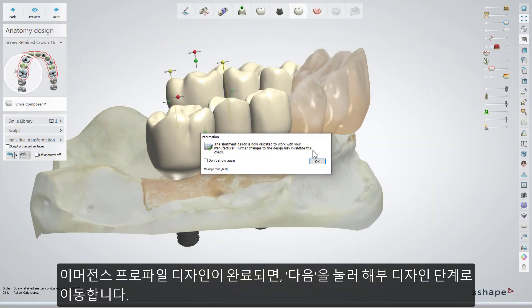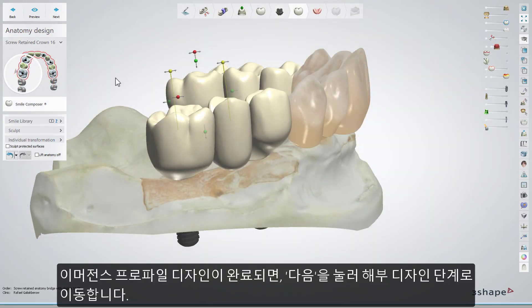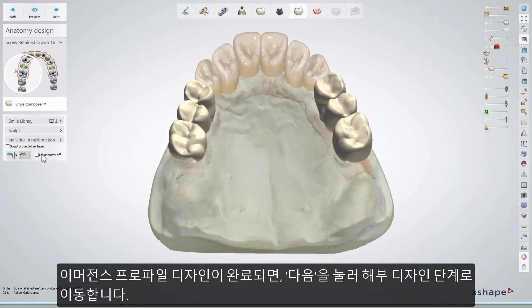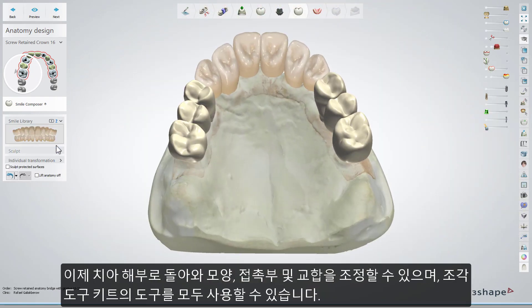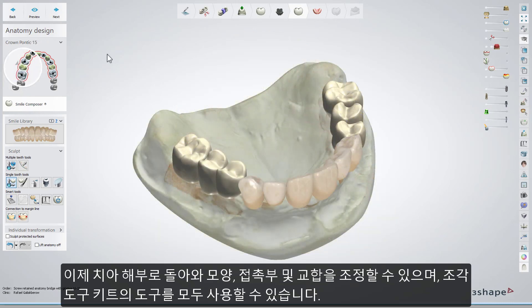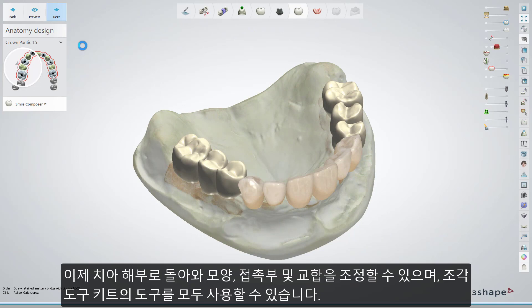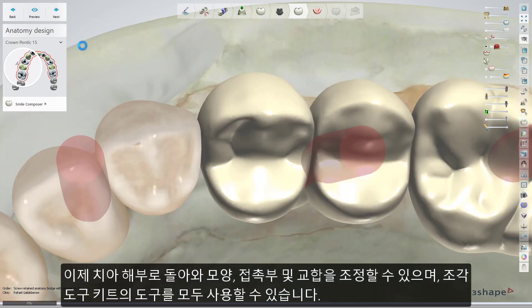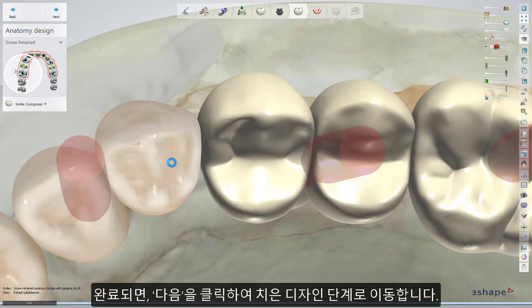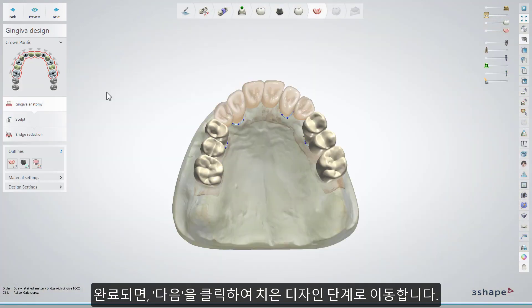After finishing the emergence profile design, click Next to go to the Anatomy design step. Now you have the teeth anatomy back, and you can work on them adjusting the shape, contact points, and occlusion. For this, you can use all the available tools in the Sculpt Toolkit. When done, click Next to get to the gingiva design step.